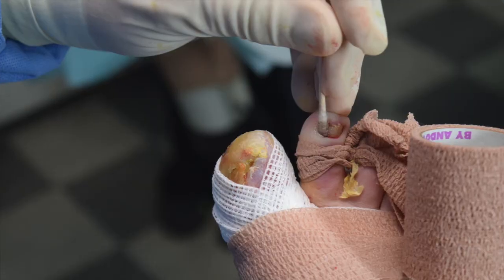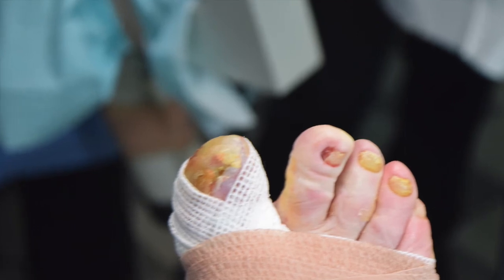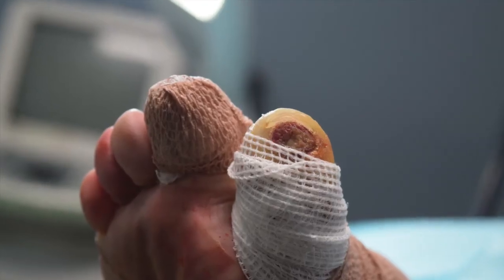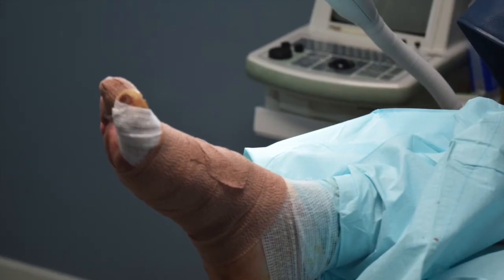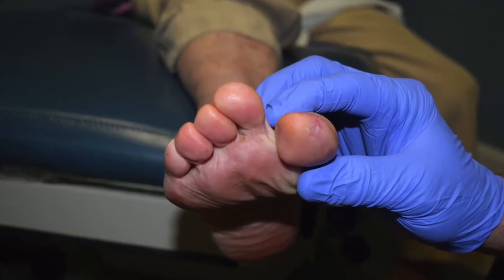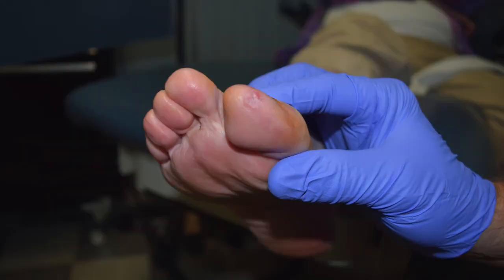So in this patient we've taken care of two problems and tried to get rid of the bone infection as well. We didn't want her to lose her toes, and she really didn't want to either. It must be noted that she had already received a recommendation for amputation by another provider, another surgeon. We wrapped it so we could keep an eye on the ulceration. Here is the ulcer at eight weeks — the toe is completely healed. The patient is happy and has no pain. She had pain with this deformity. We were able to correct this with minimally invasive surgery in the office under local anesthetic.